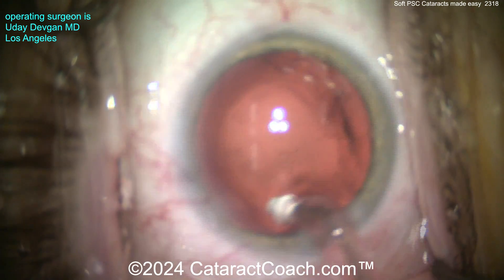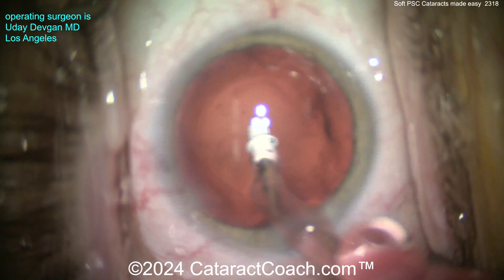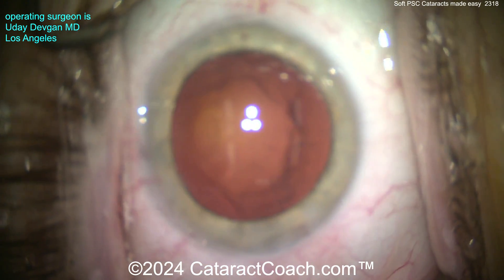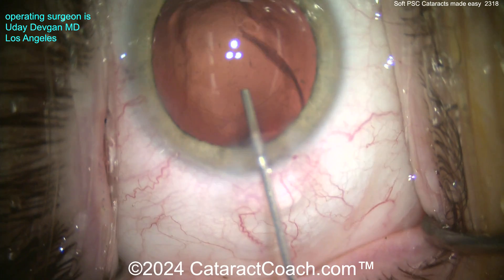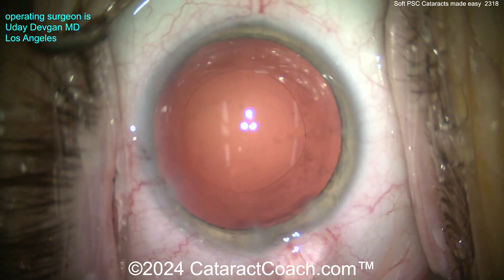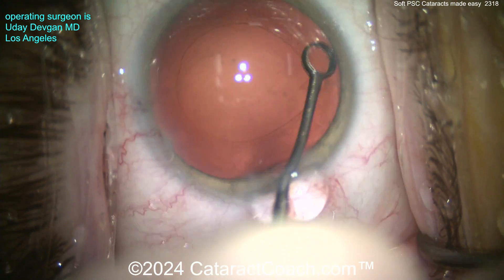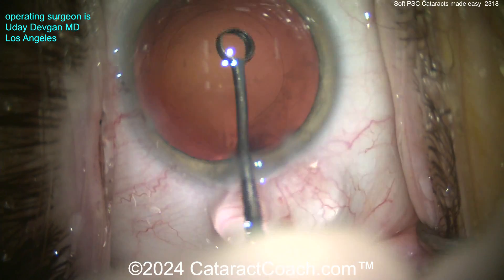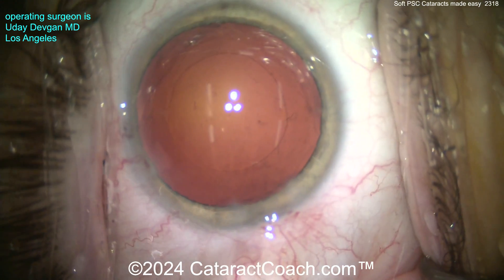Keep it going — get all the stuff out of here. Being gentle, you can always do a YAG laser capsulotomy later, but if we get that center part pretty clear, that's looking good. Injecting some viscoelastic — a little cohesive agent — and we're going to polish up the capsular bag as well. Going in with the polisher, polishing up the anterior capsular rim. I want a beautiful outcome for this patient — the same high level of surgery I'd want for my own eye. Getting all those lens epithelial cells off.